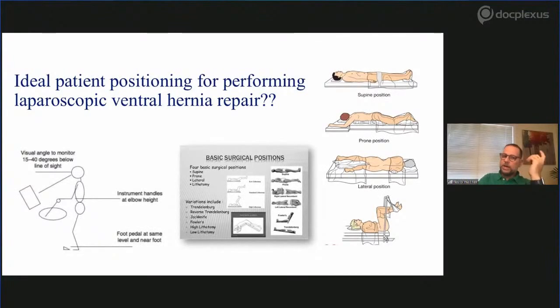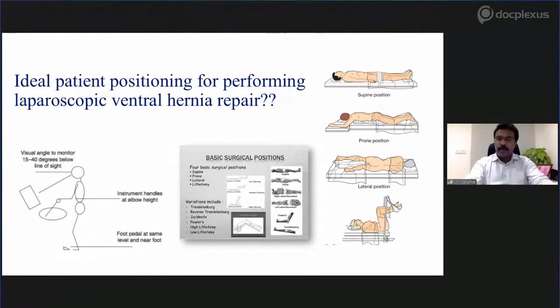But otherwise, for a healthy patient, I really do a full flex position to help me with this E-TEP robotically. The only thing we have come to understand is that the proper history is important when we are going for an E-TEP in such a position, because if the patient has back pain or previous surgery, the patient can collapse, or they can have numbness or weakness of the limb post-operatively.